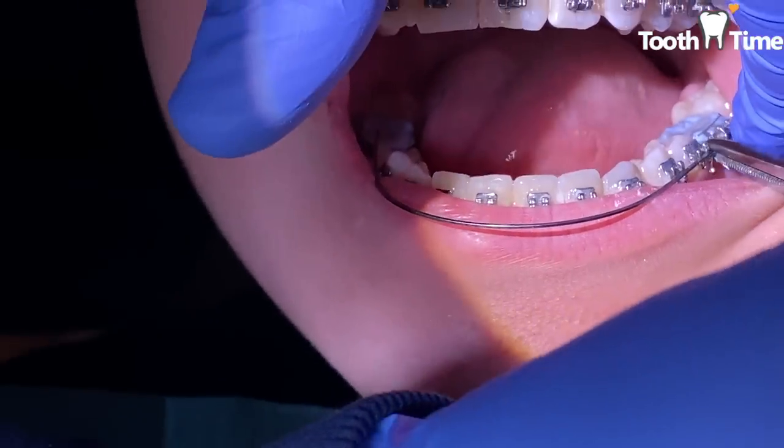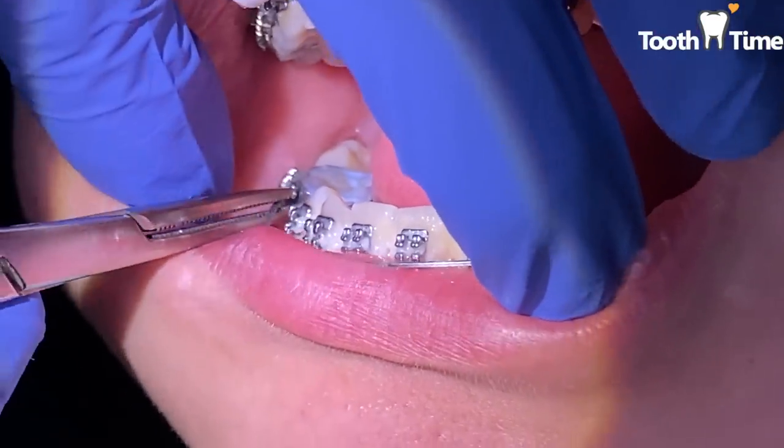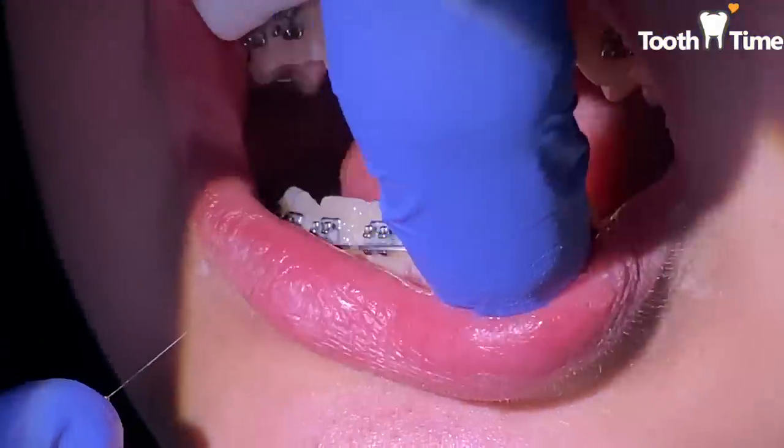Now we're going to put the same wire she had back on. There's no need for a new wire because it's already shaped to the way her teeth are and it's going to continue to activate.